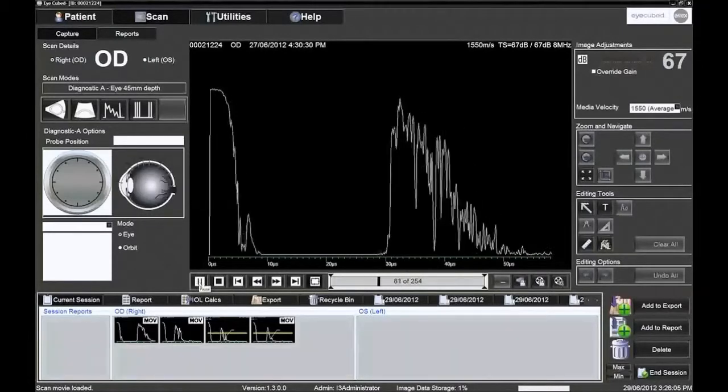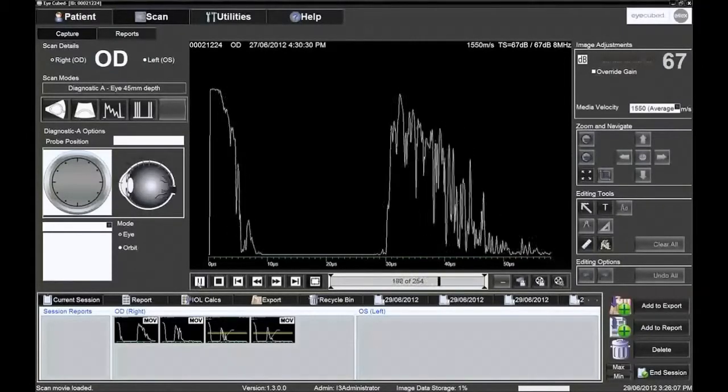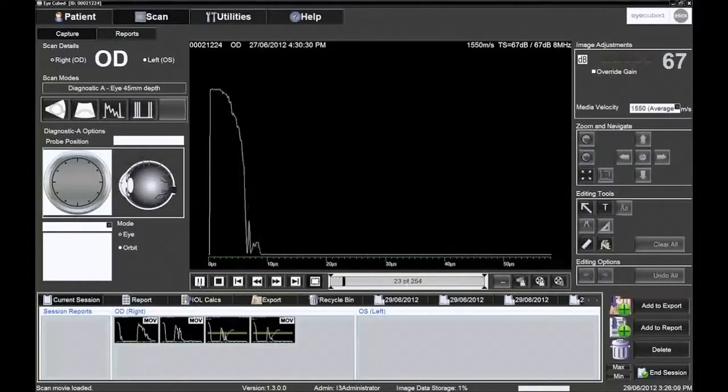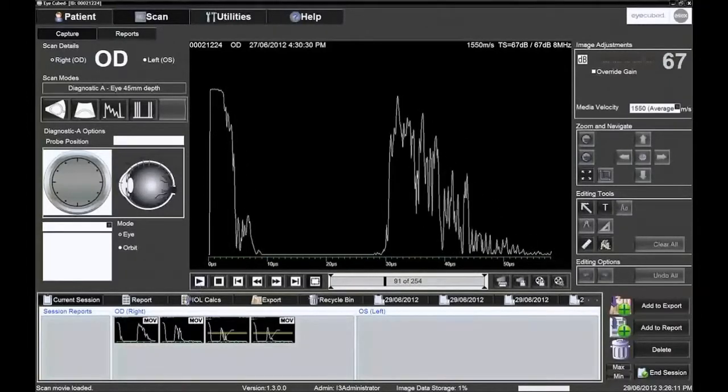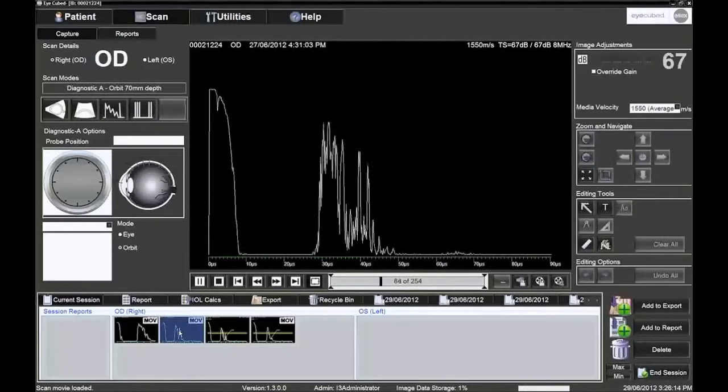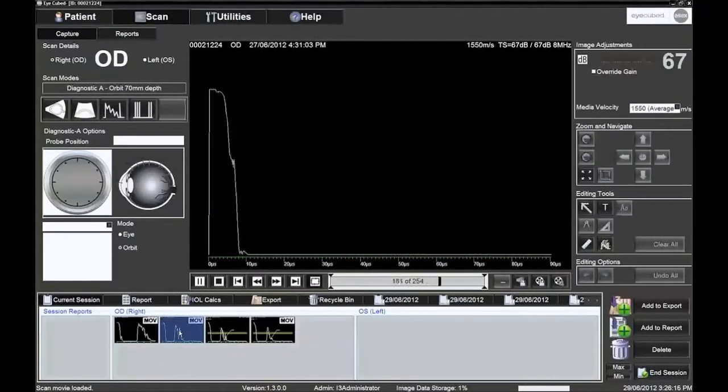Images and movies in the image tray can be reloaded for further examination. Double click to load. It is also possible to examine images from a previous session performed on the same patient.